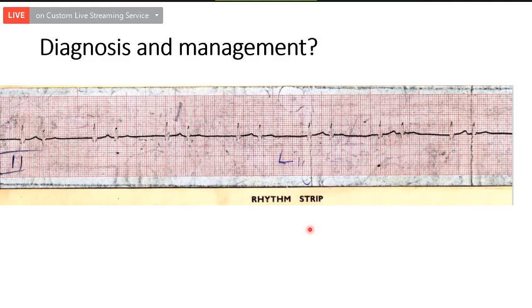Okay, repeat. Sir, atrial or ventricular ectopics. Yes, alternating atrial or ventricular ectopics with normal rhythm. Okay, right. Yes. Then Mobitz type 1, which is 3:2 block. Okay. Then atrial flutter, 2:1 or 4:1. Usually it is 2:1 and 4:1. Alternating 2:1, 4:1 conduction. Okay, yes. Very good. Third, fourth. Escape capture bigeminy. Escape capture bigeminy. Fifth.